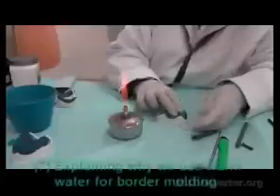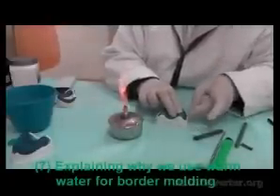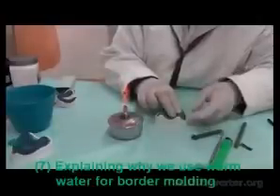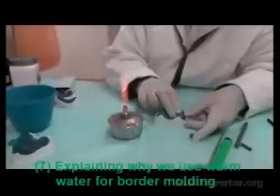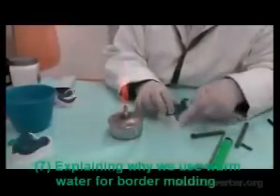Somebody could be asking, why am I cooling it in warm water, not in cold water? If I cool it in cold water or regular room temperature water, it becomes hard. I lose the pliability of the material. I lose its flexibility. In the patient's case, this is the cheek area.